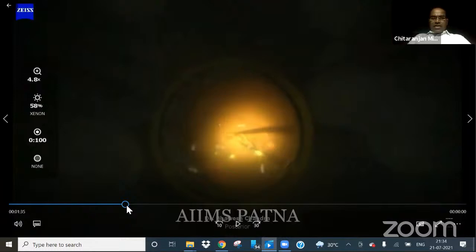See, Avnish, if the IOL is in the anterior vitreous space, the surgeon will be tempted to take it through the tunnel, maybe in the anterior route. But since we are posterior segment surgeons, it's better to allow it to fall. Do a decent vitrectomy, allow it to fall. We can take it after that. By that, we will be avoiding the vitreous tractions that will be happening.